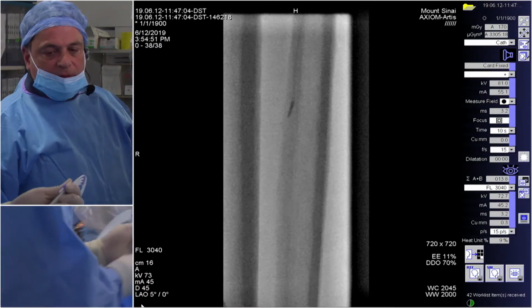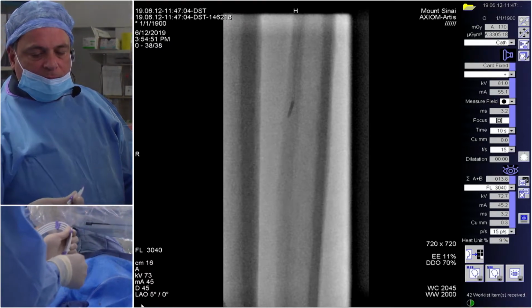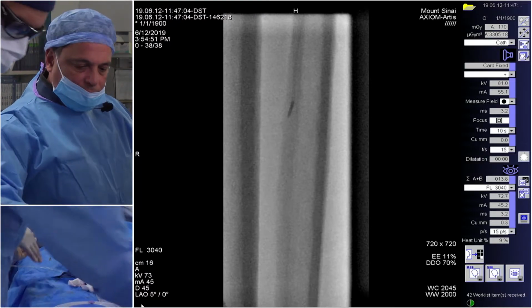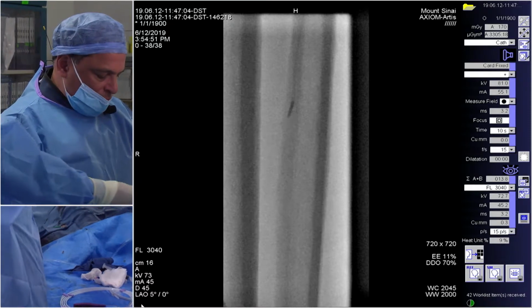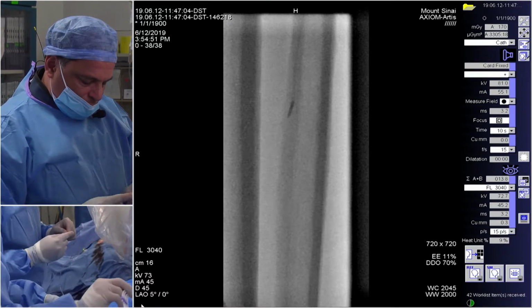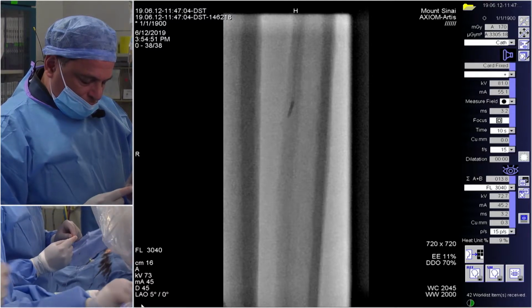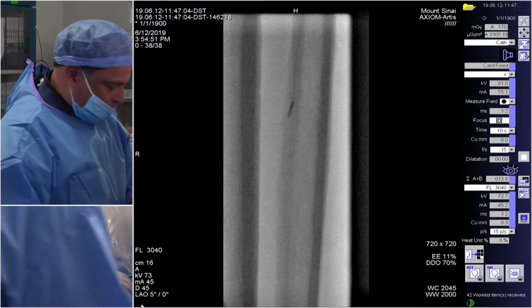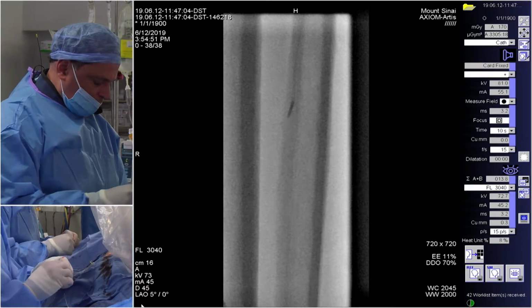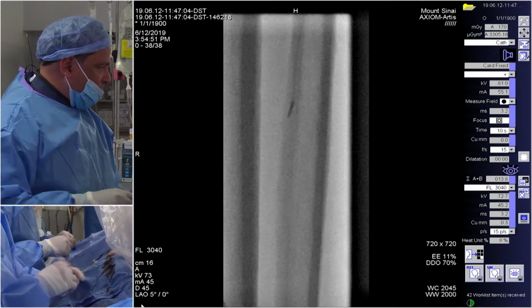That's fine. Sometimes you could use coronary reentry devices like Stingray for small vessels such as tibials. It's a little cumbersome to use them. Yeah, I would tell you that delivering the anterior there, if you're not able to deliver a 1.0 balloon, obviously we're not talking about this case, but it might be challenging because even though it's a lower profile device, it's still somewhat difficult.